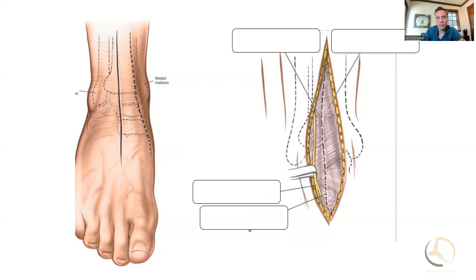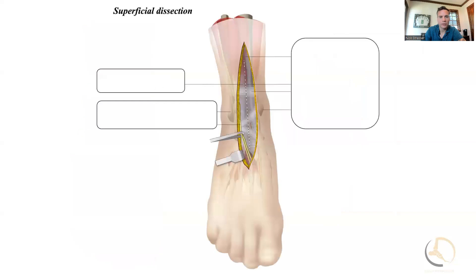I'll pull the anterior tibialis medial and pull the extensor hallucis longus lateral — I'll explain why in a moment. With the incision, I don't want to undermine a ton here. I want to try to preserve the depth because skin healing is not always that great in this area, and I'll discuss that in a few seconds.